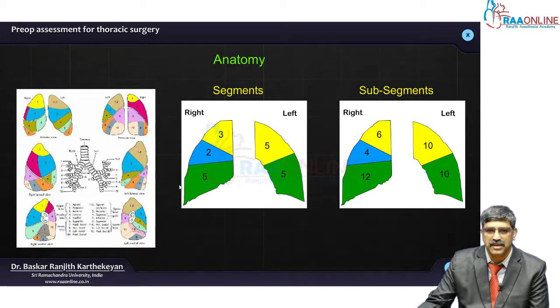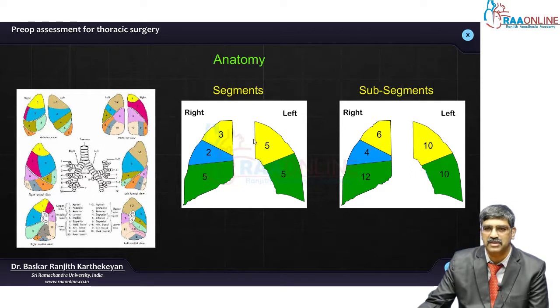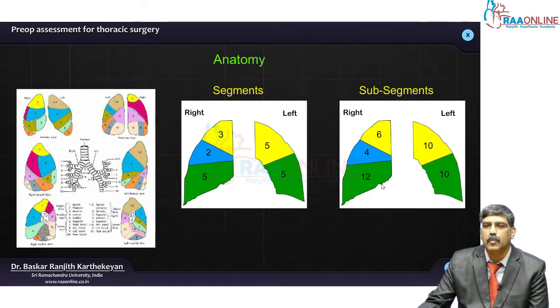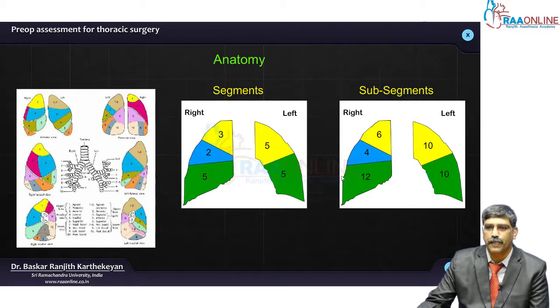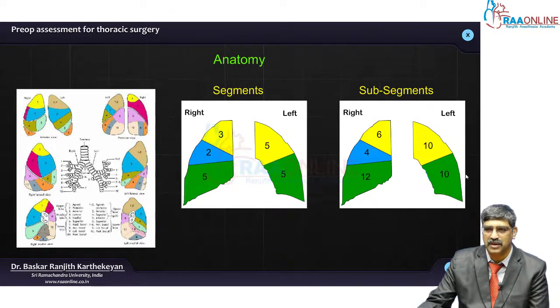Traditionally, there are 10 segments on the right side and 10 segments on the left side. Some textbooks say 9 segments on the left side. But if you take sub-segments, there are 22 sub-segments on the right side and 20 segments on the left side.